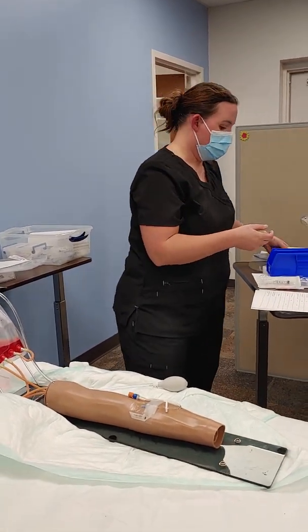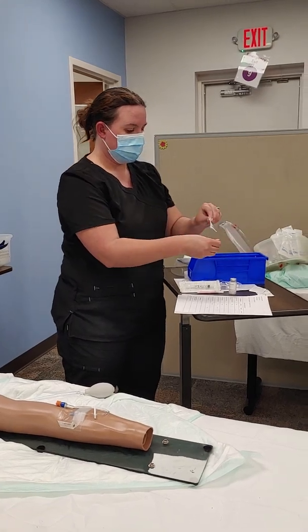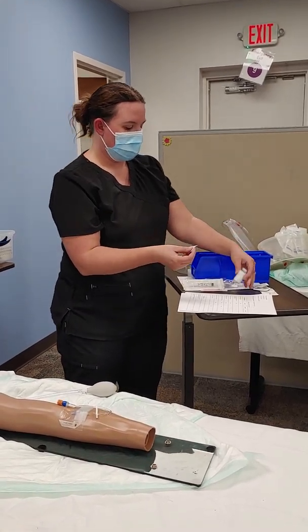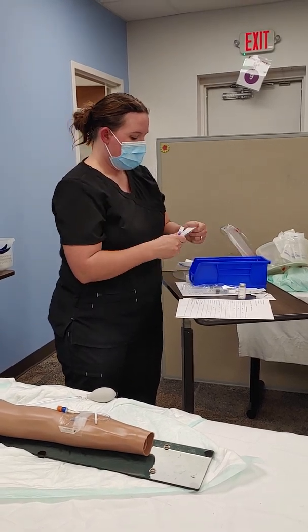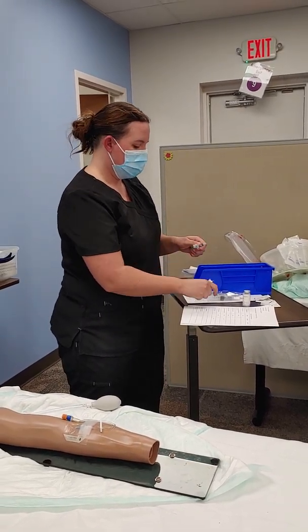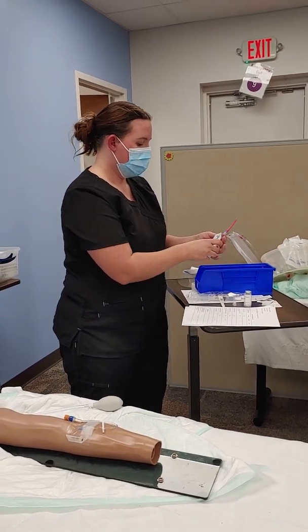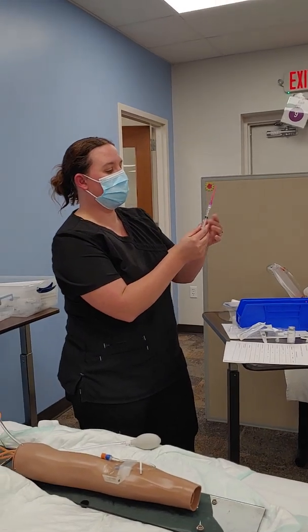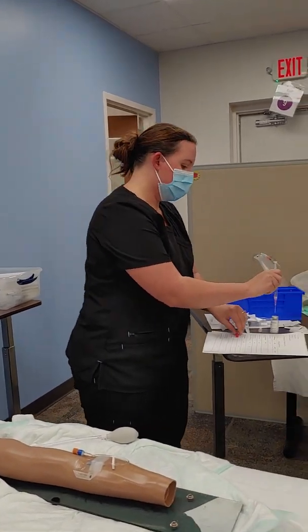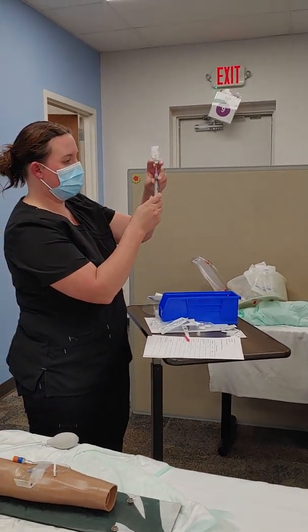Okay? Correctly draw up medication for order using sterile technique and verify its correct drug and dose with instructor. So I clean the top of my vial off. I'm going to grab my syringe. I know I need 2 milliliters of the medication. So I'm going to insert 2 milliliters of air. Flip it.